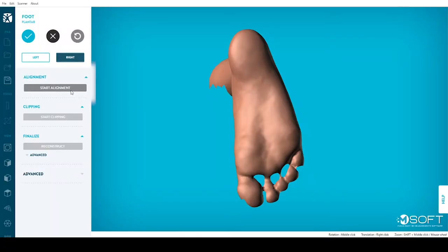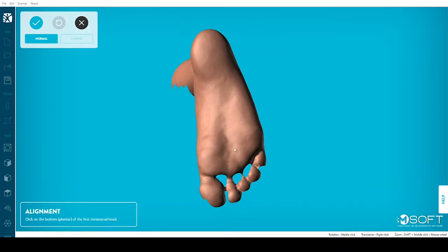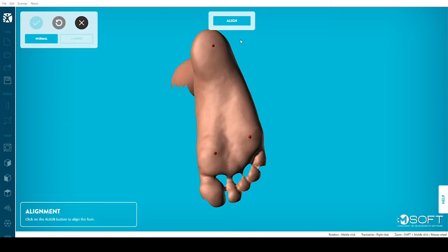Aligning your scan will indicate to M-Soft where are the toes, the heel, and the floor. Click to identify the bottom of the first metatarsal head, then the fifth metatarsal head, and finally the bottom of the heel. Respecting this order is essential.